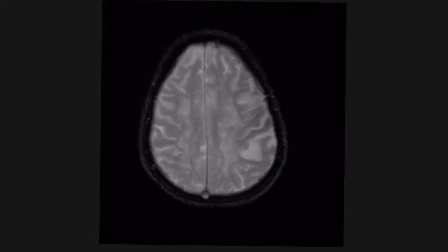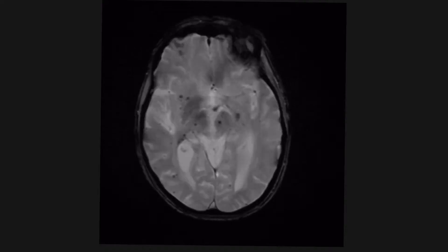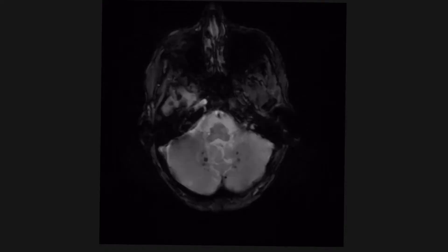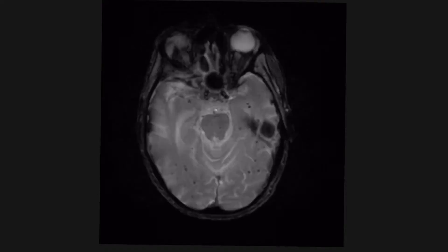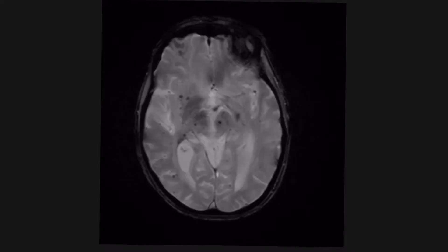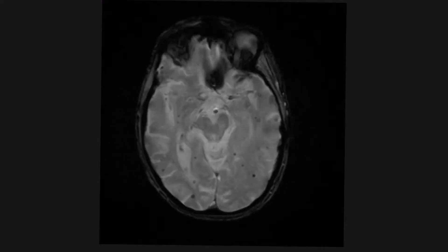On this T2 star sequence, we can see multiple areas of low signal which are in keeping with haemosiderin deposition. This is a case of amyloid angiopathy in which these microhaemorrhages occur usually at the grey-white matter junction.